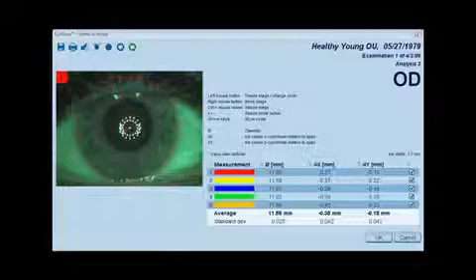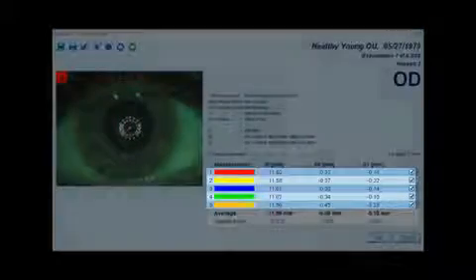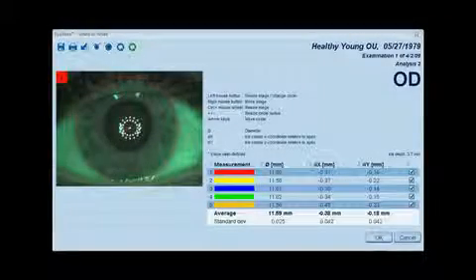The instant white to white measurement is taken from the digital image of the eye, which is taken automatically at the end of the Lenstar scan.